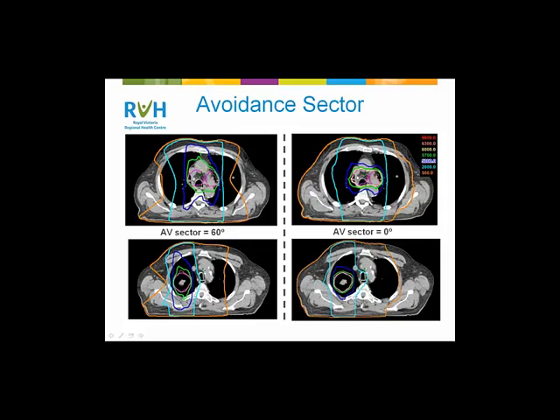You know how sometimes with RapidArc you can see these plans when you play the movie and the MLC is dancing all over the place and you've got little specks of MLC open scattered around the field? That kind of stuff makes me nervous, especially with respect to lung when there's motion and we know interplay is going on. I was more comfortable when field apertures were larger. I found with a 45-degree collimator, the field apertures stayed more contiguous and were larger than with smaller angles. So that's why we used that. But we didn't validate that with measurements or anything like that.